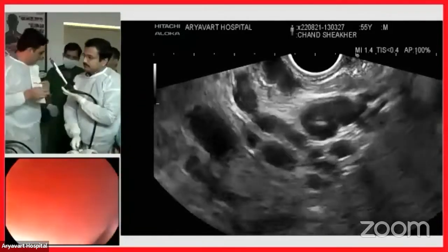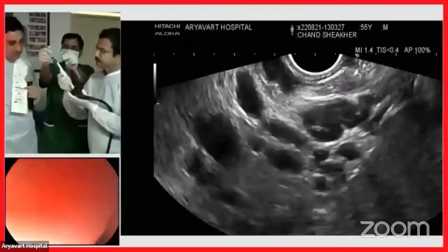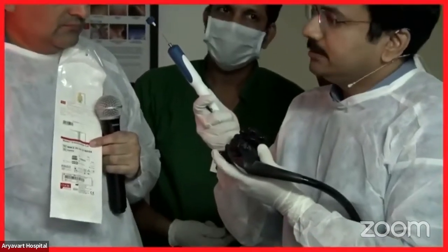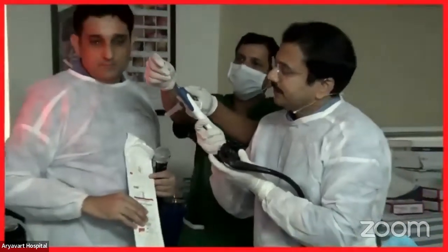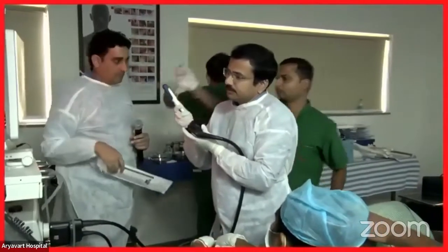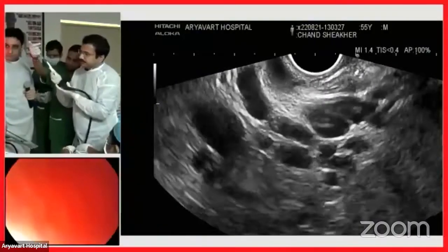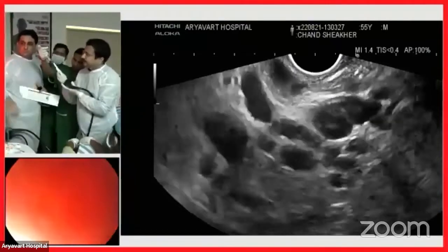The needle is ready — a 19G needle. One important step: take out the stylet and prime the needle with saline. We do not want any air or anything getting inside the varix or the field. Once we have primed that, we are going to puncture.